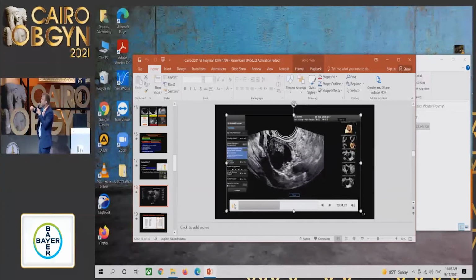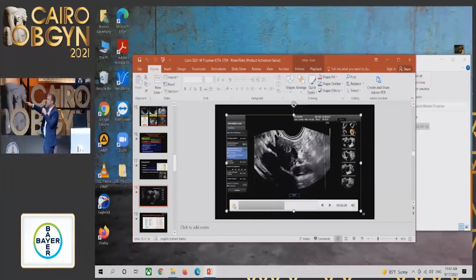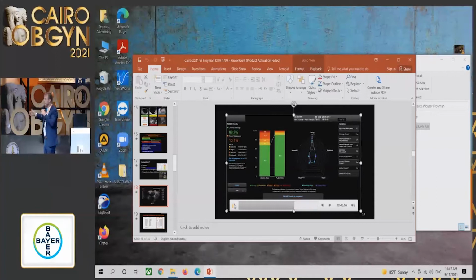So that's about 14 millimeters. And then the questions, are there more than 10 locules? No, there's only 1 locule. Number of papillations, there are 2. Shadows, yes, no ascites, and up, you have the risk of malignancy, which is here 10%. So without a loss of a lot of time, you're able to calculate the malignancy risk. I will proceed with the next slide now.